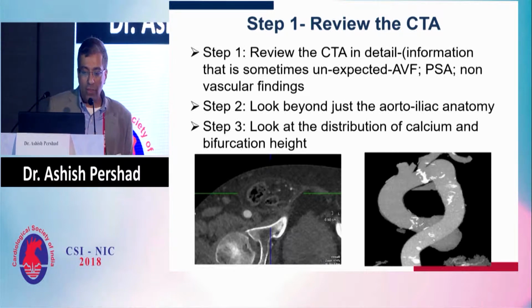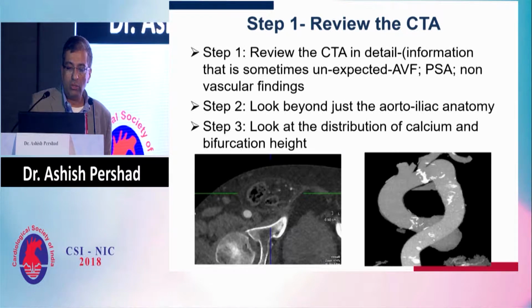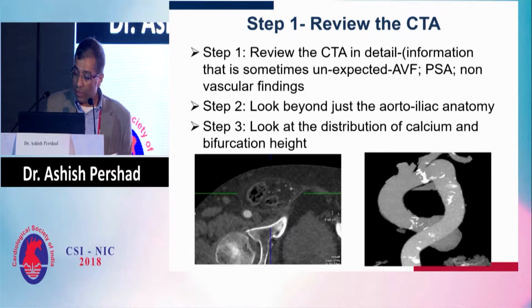for example, the panel on the right shows a patient who has a sigmoid S-shaped aorta in the thorax. And that's something that you want to look at and be considerate of when you try to advance a Sapien sheath, or even, for example, a core valve sheath into the arch, because a couple of things are going to happen. One, you're going to bias towards the outer wall if you can even get across that. And secondly, you'll have trouble loading the S3, for example, because you don't have a straight segment in the aorta. So that's the first step I do for all cases.